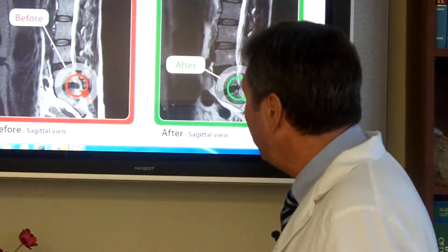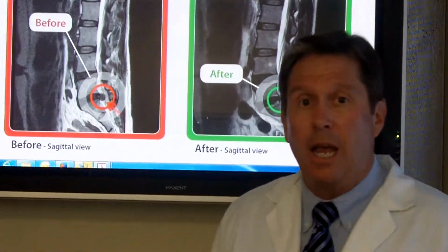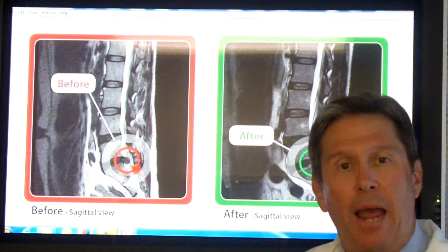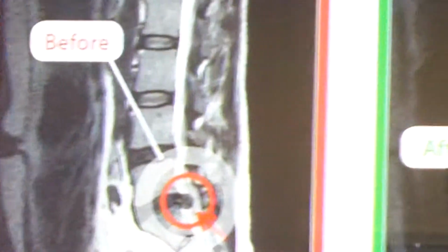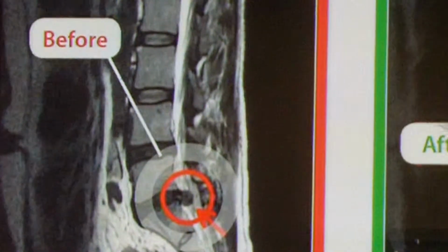Here is a great example of a patient of ours who was suffering with an 11 millimeter extruded disc at L5-S1, and he was failing to respond at the normal pulling angles. We tried pulling him at a very high angle, a 25-degree angle, which would normally be for L1, L2. And he suddenly turned around, things went great, and he was doing better.